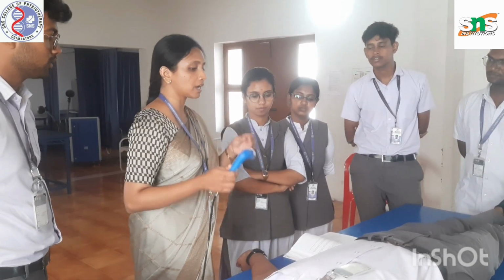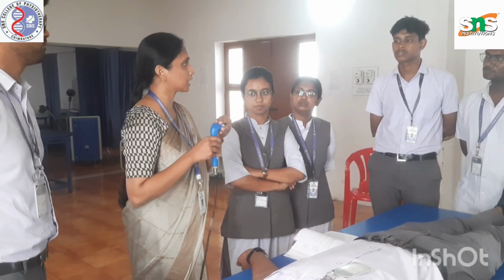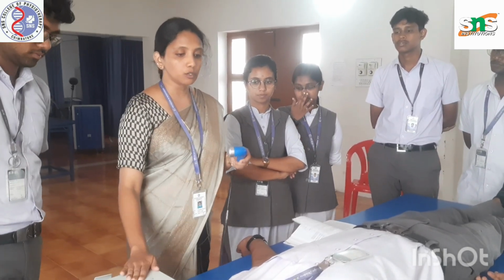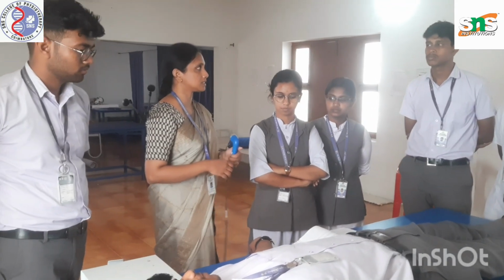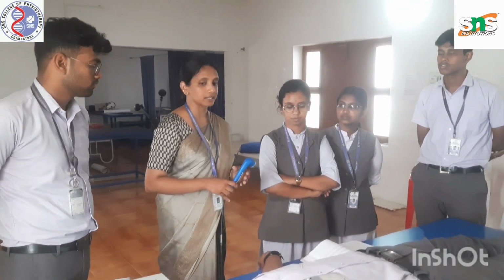Okay. So in this session you all learned about the techniques, the indications, the contraindications, how you have to use the apparatus, and what care has to be given for the crystal, all those things. Okay. Yes, you should recall this again and again when you are using ultrasound.